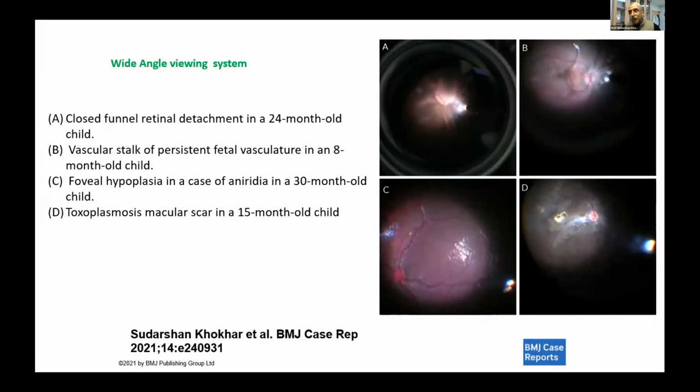And whenever the patient comes to us, we have the records with us. And we give a copy to the patient also. This is a very small technique. Since you're already doing vitrectomy, you don't have to go with the light probe all the way. From the limbus, you can stay in the pupillary plane. That light is good enough to pick up everything from the back. You just need a wide angle with you, and you have to have a microscope with an inverter.